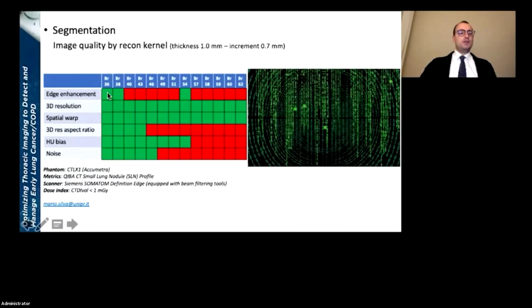But of course, when you take a look at these images and evaluate them visually, they might not be as good as you want. These are actually the kernels that you want to have when you read the images visually.